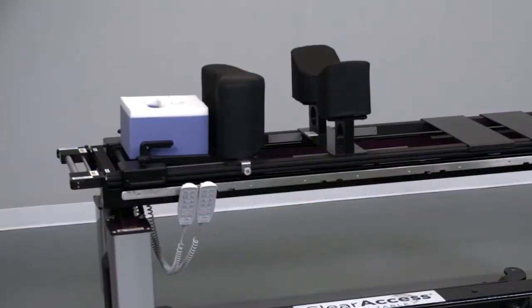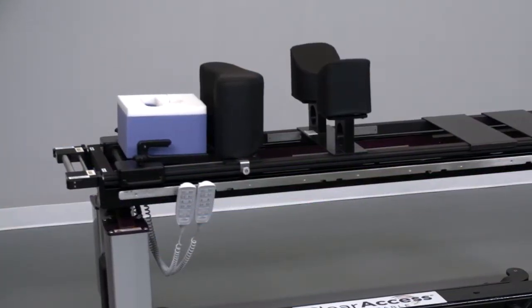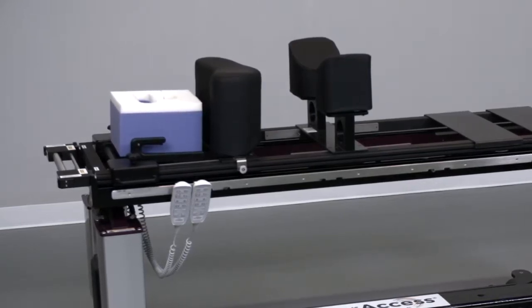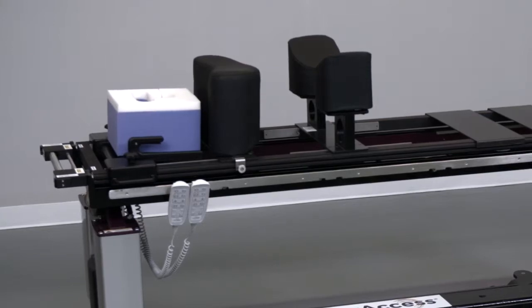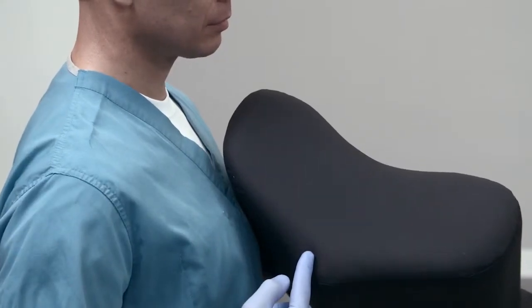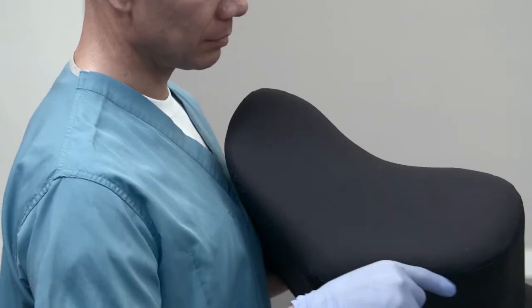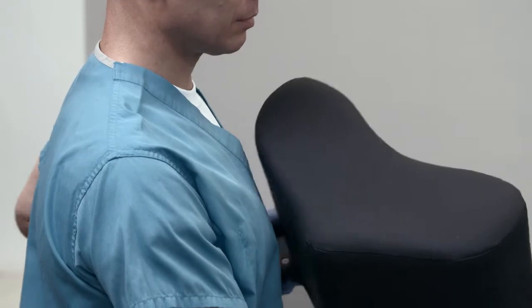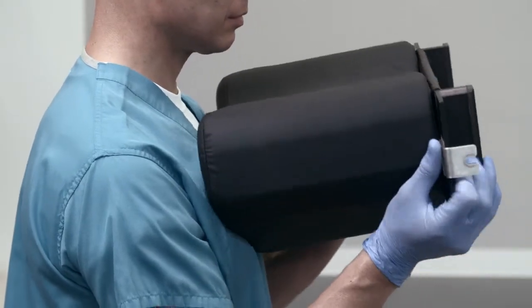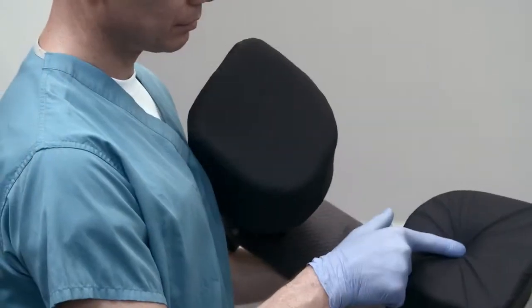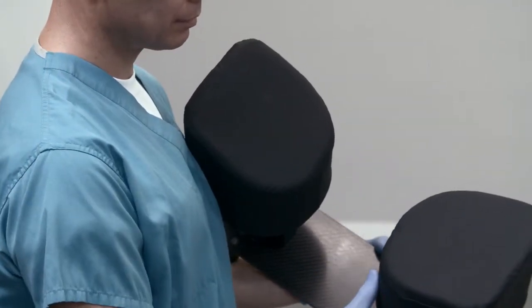The ClearAccess open frame spine platform is sometimes generically referred to as a four poster frame. It consists of a chest piece and a pelvic support system. The middle of the heart shaped chest piece is intended to support the sternum of the patient and the cutouts on the bottom of the chest piece are intended to accommodate the breasts of female patients. The pelvic system is designed to support the iliac crest of the patient.